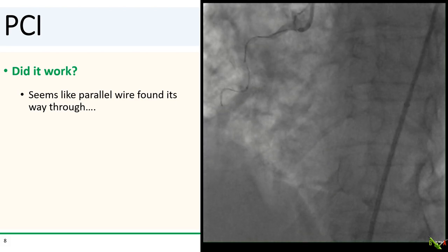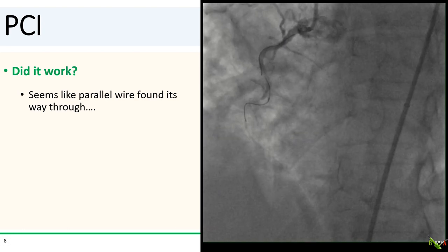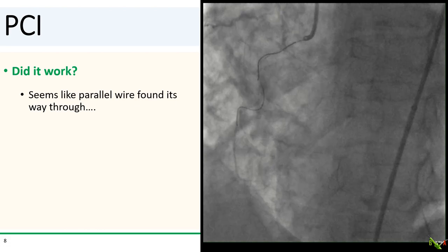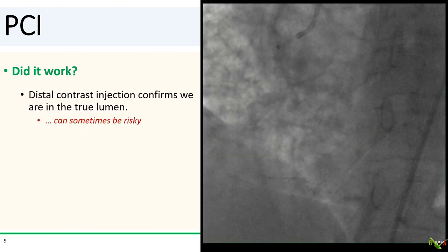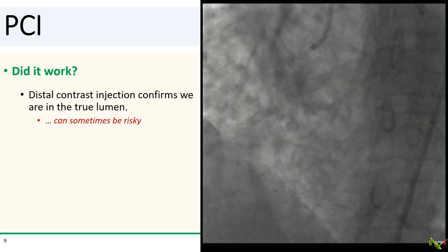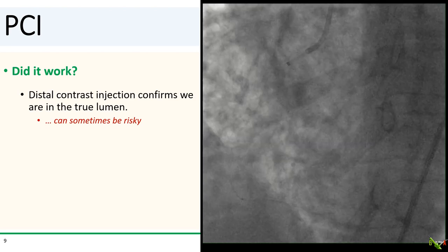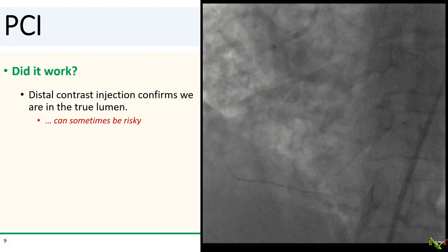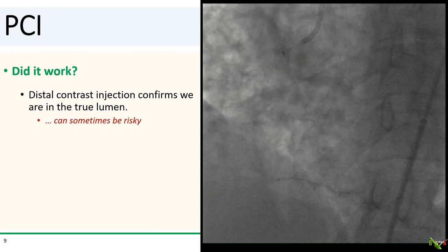We left our dissected wire in place and used a Pilot 200 wire as a parallel wire via a fine cross, and it seems like the Pilot 200 wire quickly found its way through. We did a distal contrast injection, and indeed we are true lumen. Distal contrast injection can sometimes be risky though, because if you're in the false lumen, you can dramatically enlarge it and make it very difficult to re-enter. Contralateral injections are safer. However, we did not have much of a choice in our case, because there were no left or right collaterals for opacifying the RCA using a contrast injection.